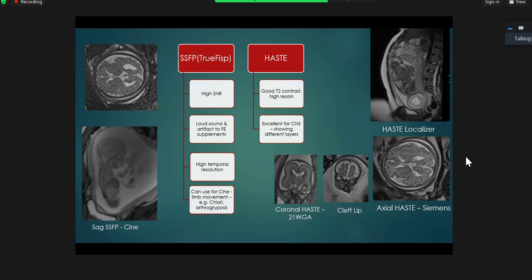We typically want to assess the lower extremities, the ankle, knee, and hip joints, for motion in the fetus in utero, because that has prognostic value postnatally. And another entity called arthrogryposis, where there is lack of movement of the limbs, both upper and lower, in babies with arthrogryposis, can affect either just one limb or all limbs.